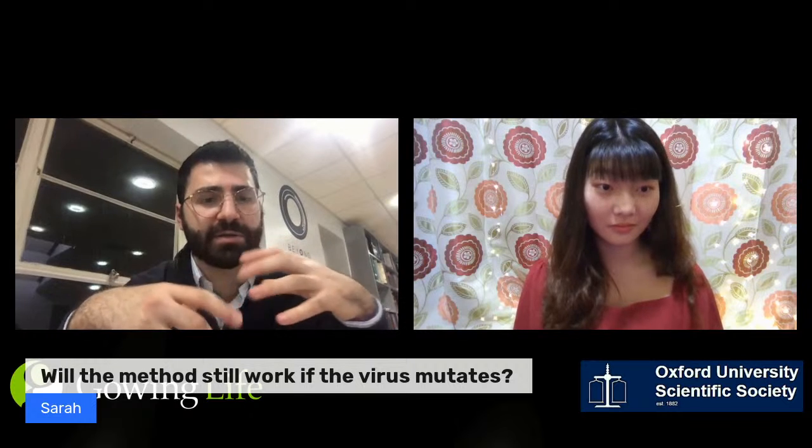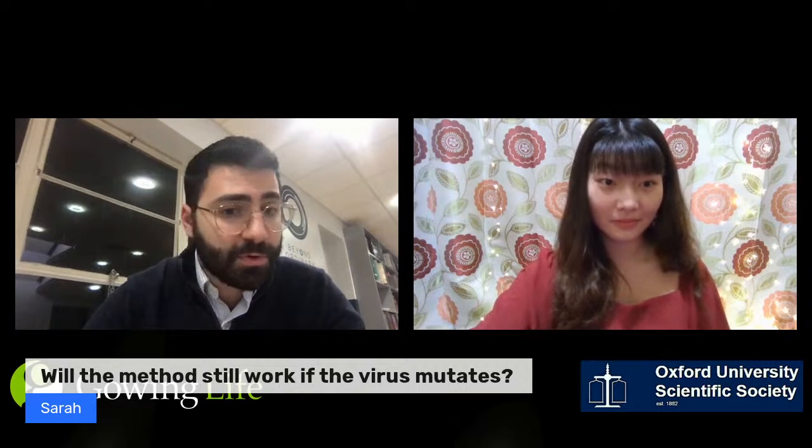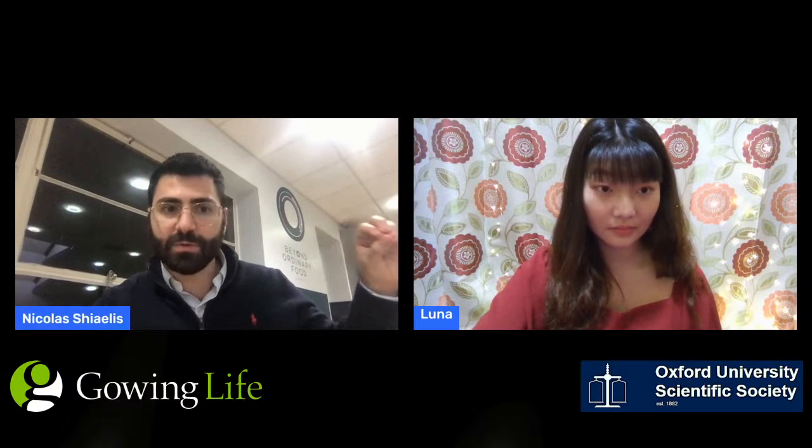between the different parts. So presumably, it depends on the extent of the mutation, what mutates, but also when we do clinical samples, if it's trained on them, if a mutation is currently circulating, because we are training on it and because we are always able to save the data that we go through, if we perform a test, there is some data that gets stored, we can always retrain and go back and improve our results.